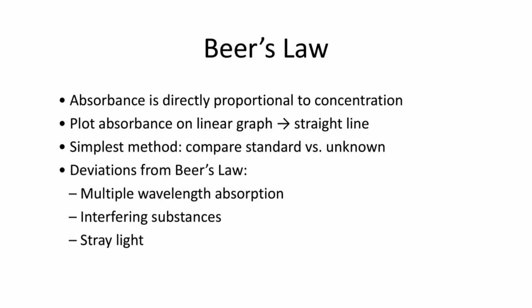Beer's law states that if measurement is made in absorbance and plotted on linear graph paper, the concentration of the substance is directly proportional to the amount of light absorbed. In practice, Beer's law is used to calculate concentration by rearranging the formula. A simple application involves comparing the absorbance of a known standard with that of an unknown patient or control sample.